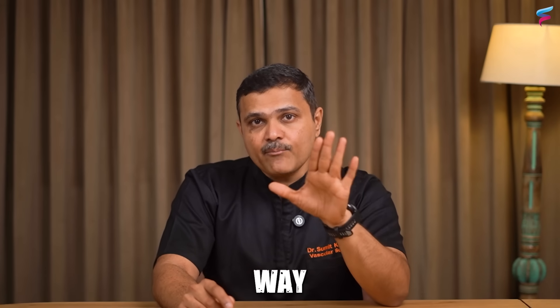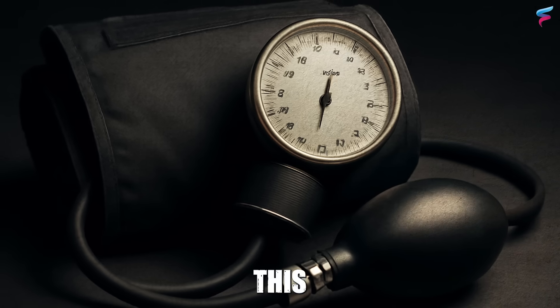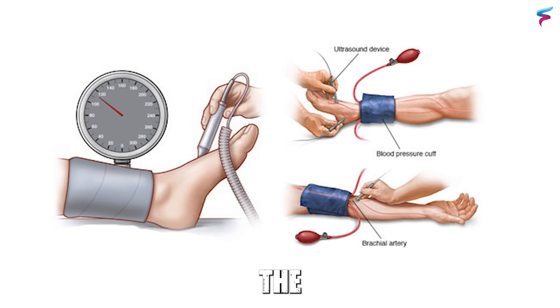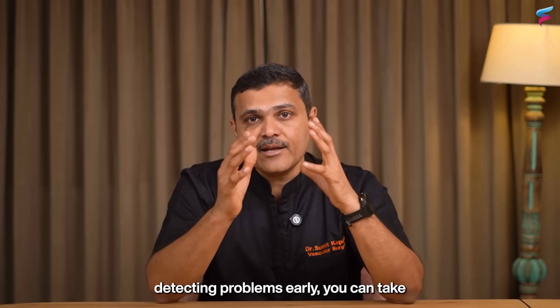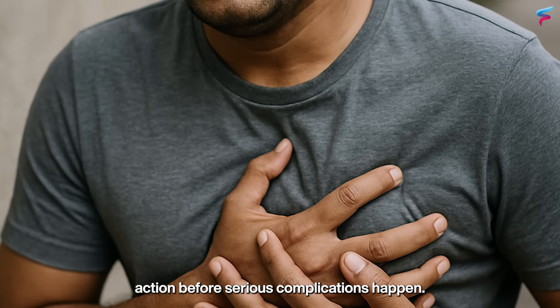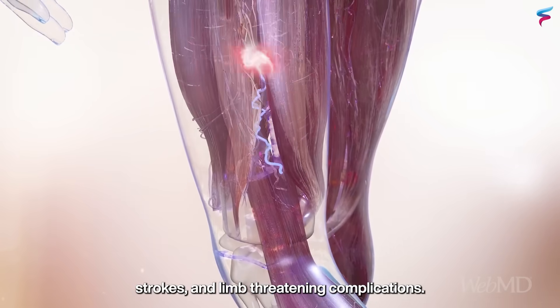What if there is a simple way to get an idea about the health of your arteries at home using just a blood pressure cuff? This is not just a trick or a quick hack. It is a medically proven method called the Ankle Brachial Index or ABI — a simple, non-invasive method to screen for blocked arteries in your legs. Detecting problems early can help prevent heart attacks, strokes, and limb-threatening complications.